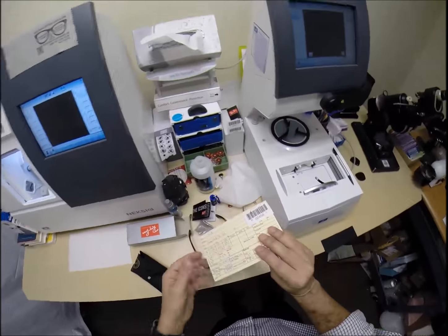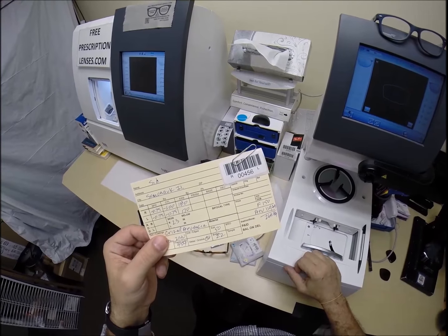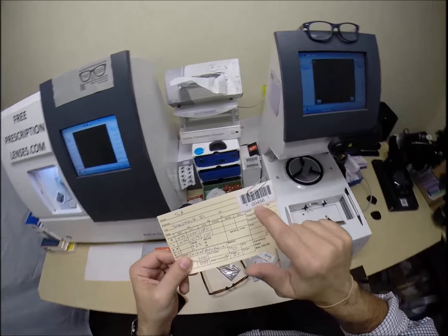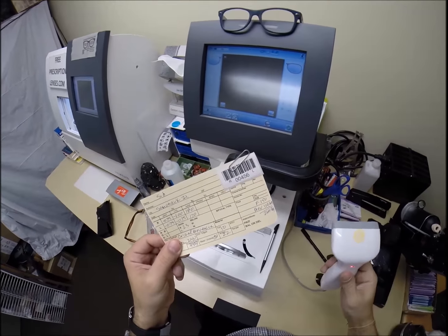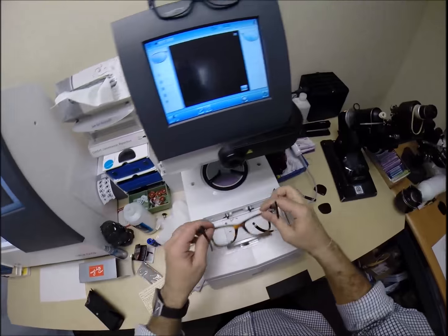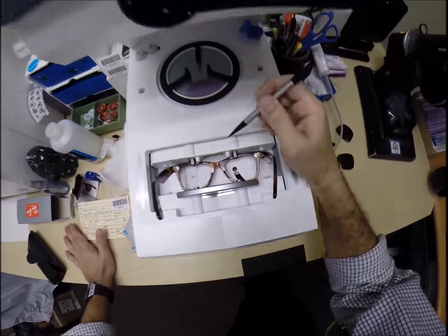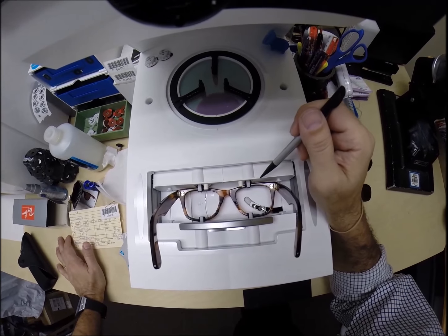But you are volume 456 in my 250 million series of Make a Pair of Glasses for Everyone in the US. So I'm going to program this shape. You are never a number, Sid, unless that number is 456. Then you are Secret Agent 456. I'm going to scan that into the computer. I'm going to take your frame, put it into the tracing element of my blocker, and hit start. So years from now, if you ever need new lenses, it's going to be programmed in there, and I can send lenses right to your home.